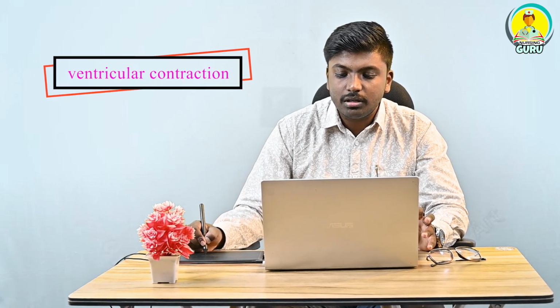The QRS complex is ventricular contraction, and T represents ventricular relaxation. We can also say it as depolarization and repolarization. So in P, atrial depolarization occurs, and it is represented by the P wave. Can you see this? Yes, hope you can see this. The QRS complex is ventricular depolarization.